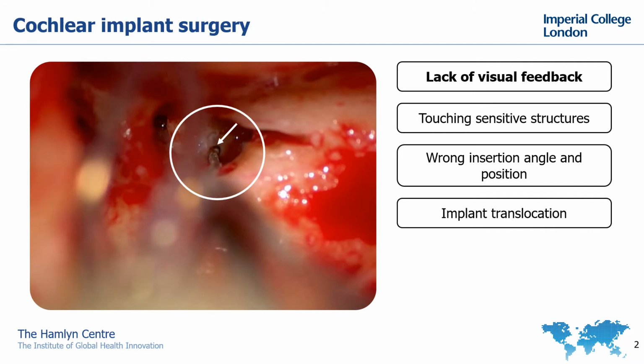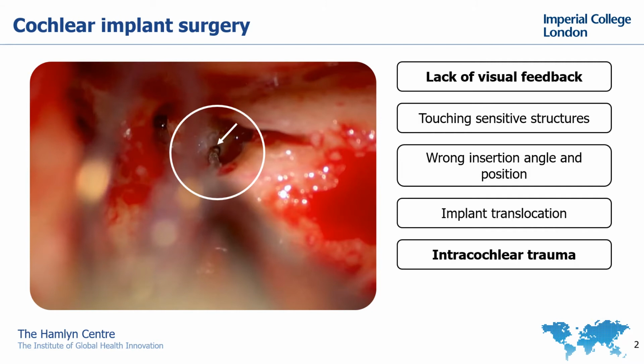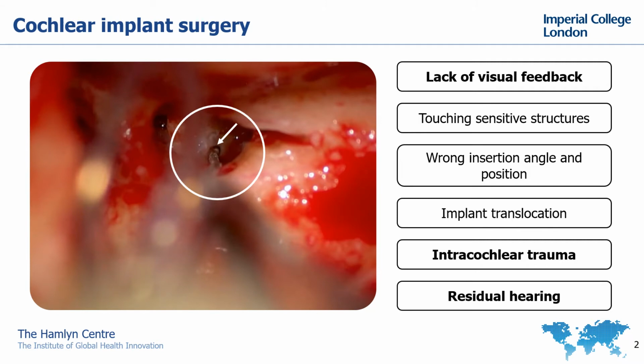As a result of all these problems, we can generate what we call intracochlear trauma. And intracochlear trauma does not allow for residual hearing preservation, which is very important to provide the patient with better hearing outcomes.